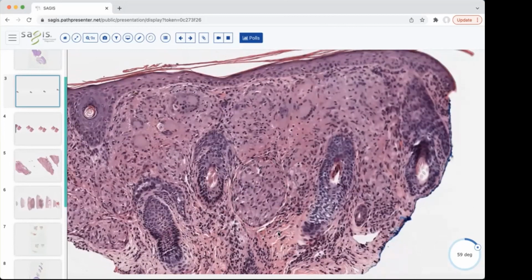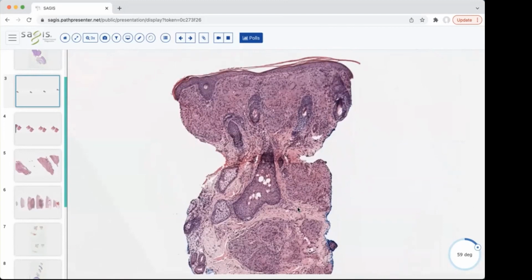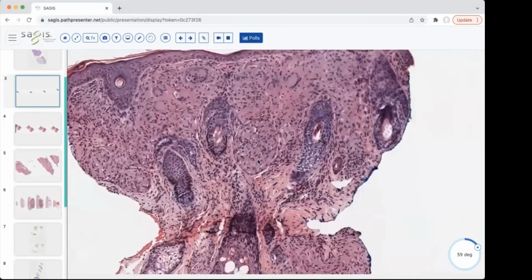The giant cells here are a little bit easier to see. Some of them even contain a little bit of hemosiderin. So a sarcoidal granulomatous dermatitis on the face, that's essentially a differential, and the dermatopathologist can help tease out what that's going to be clinically for the patient. But these are the discrete naked granulomas. People say naked because they have few surrounding lymphocytes. And I think the other kicker here is that there's no necrosis within the granulomas themselves. So there's only cells. You don't see any dead necrotic tissue on the inside of them.